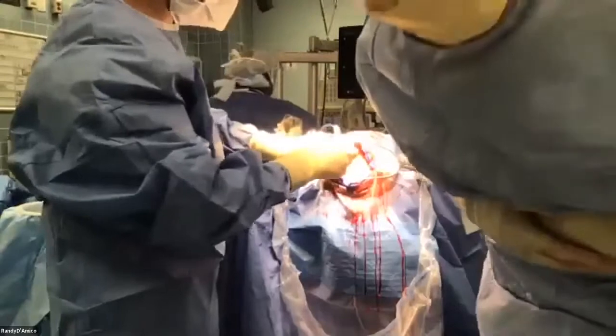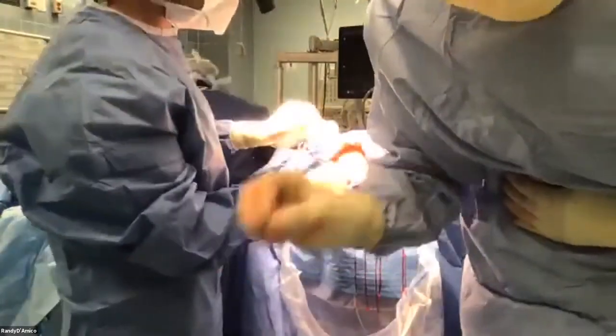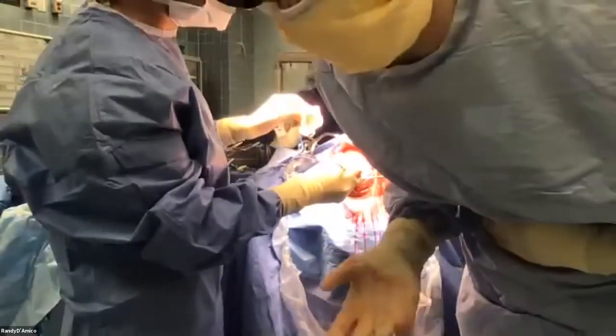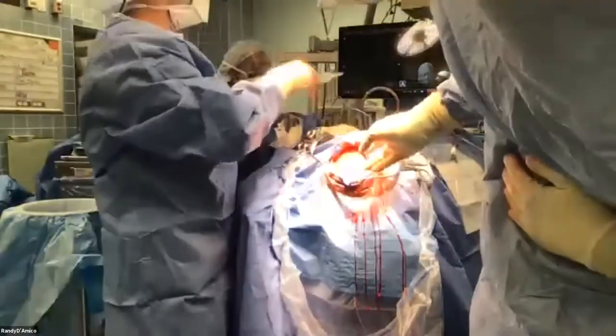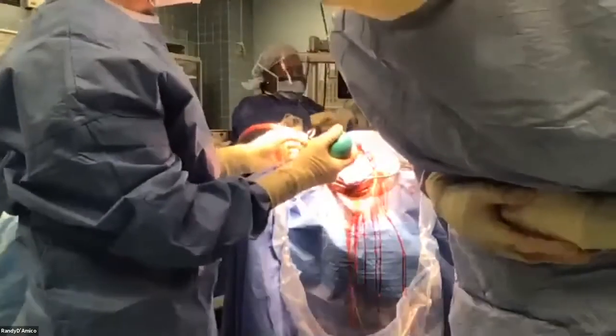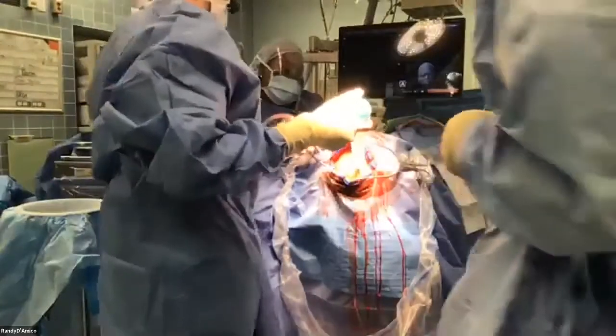So we've marked out where the tumor is. We have to mark out the midline. This is a parasagittal meningioma, which means it occurs growing right next to the superior sagittal sinus, which is the main draining vein for the brain, basically. And so now what we're going to do is some bone work. And this is going to be a little bit boring. We're going to pay attention. We have to be very careful about the superior sagittal sinus so that we don't cause any injury to it. So sit tight, all right? Tumor's coming.